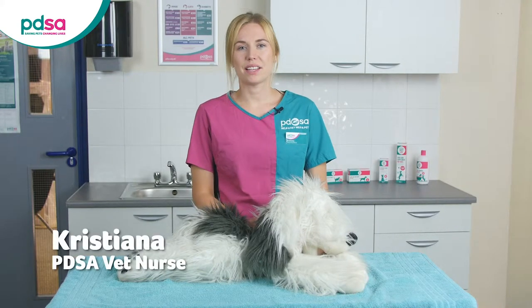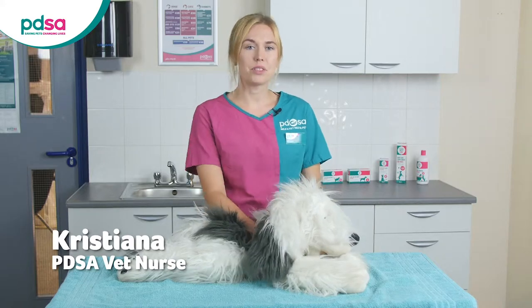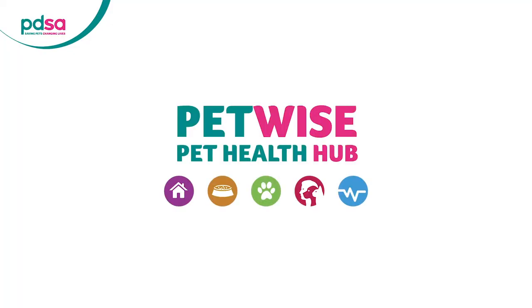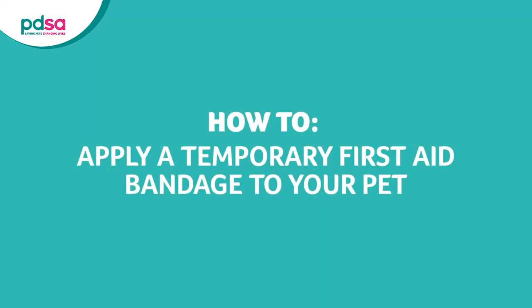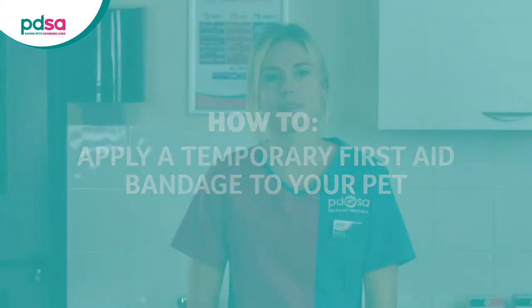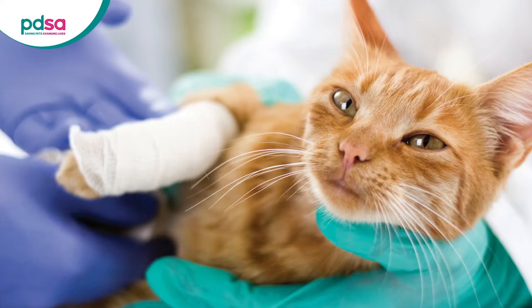Hi, I'm PDSA Vet Nurse Christiana and today I'm going to show you how to apply a bandage, demonstrating on this soft toy. If your pet has a cut or graze on their leg or paw, you can apply a bandage as a temporary first aid measure to stop the bleeding and help protect the area. This is until you can get it checked by the vet.